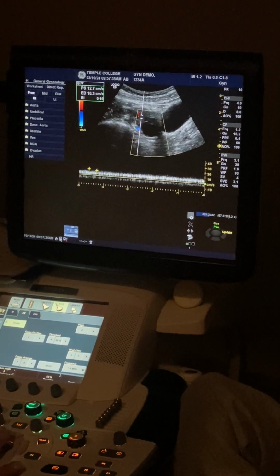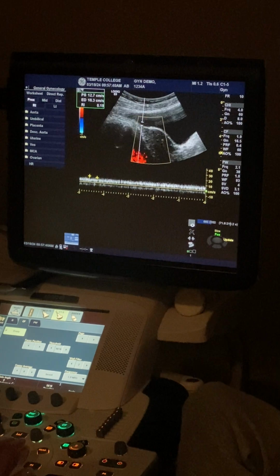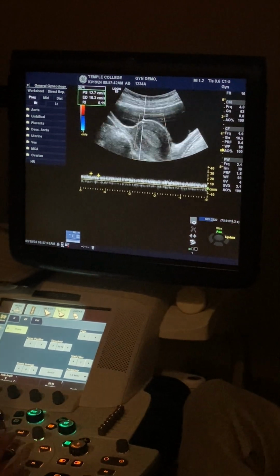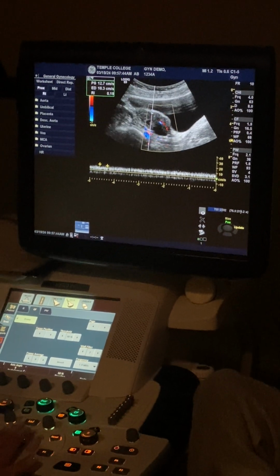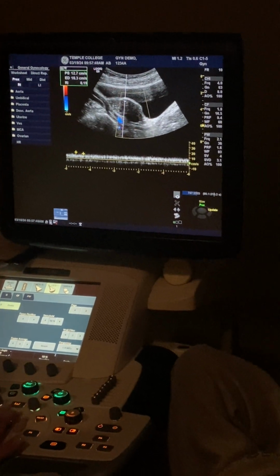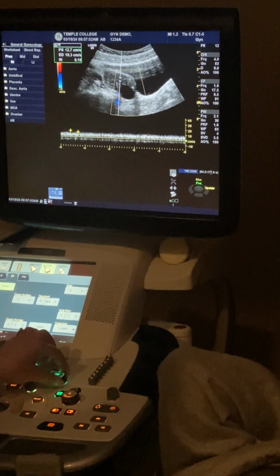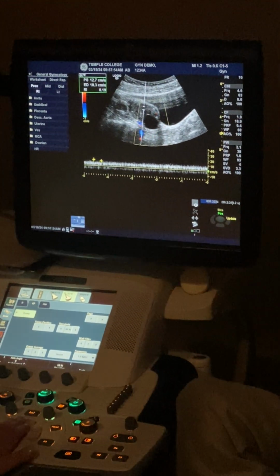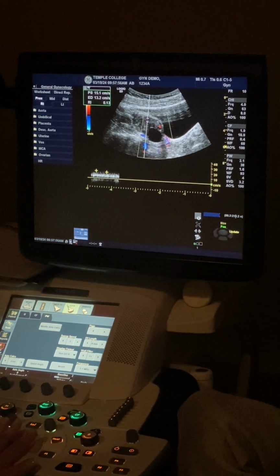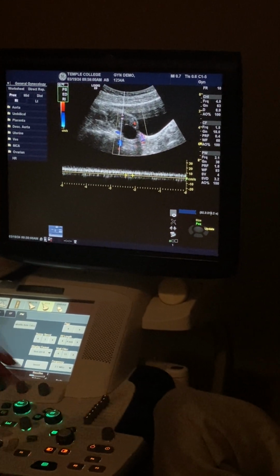So make sure when you're getting it in the ovary, not in the tube. Do y'all see how I kind of went from like tube and now full into ovary? Alright, there it is. Do y'all see that bottom one?